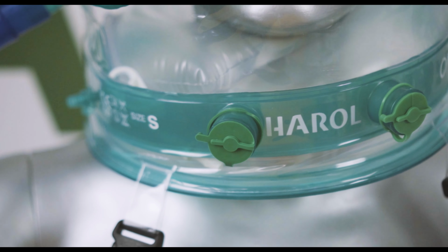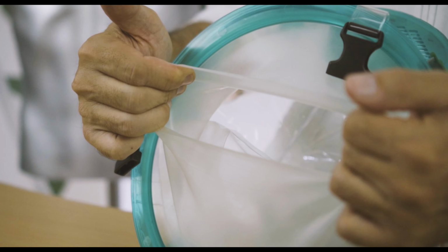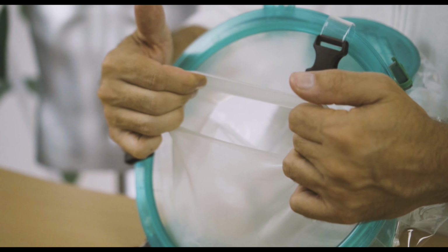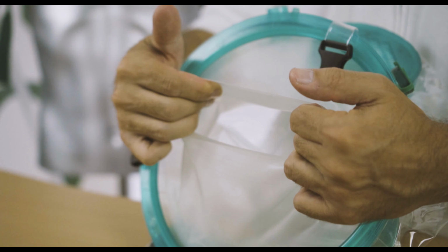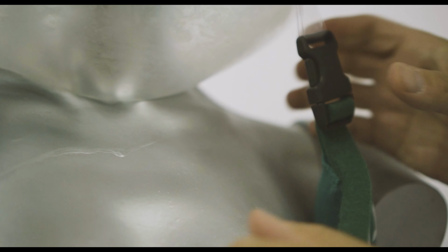Then we have to choose the type of collar, polyurethane or silicone. The silicone collar is more elastic and ensures a seal on the neck. It is a bit more expensive, but offers better performance. The polyurethane helmet offers a seal on the upper part of the thorax, and requires the straps to be more taut during use.